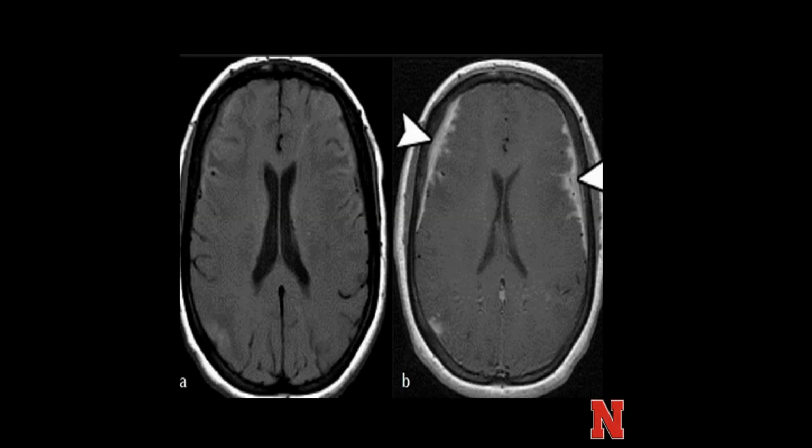Here's an example of a T1 weighted image on the left, and this is a T1 weighted image post contrast. You can see this person had leptomeningeal metastases, and they had this thickening, enhancing masses along their leptomeninges. They weren't real obvious on the T1 pre-contrast or really pop out after contrast. The only difference between these two sequences, again, is contrast, so you know that this has to be a vascular enhancing abnormality.